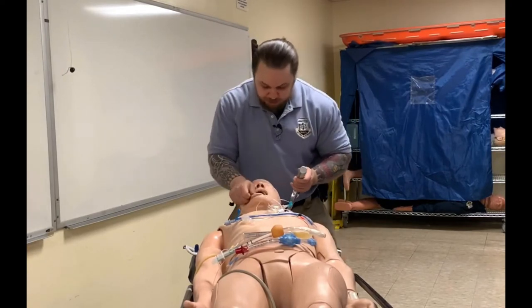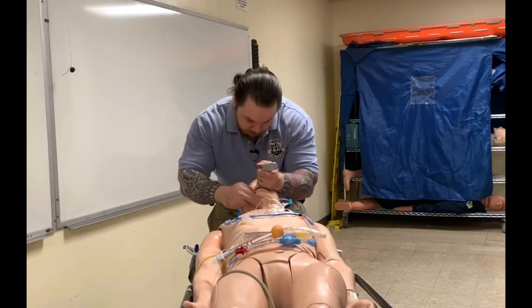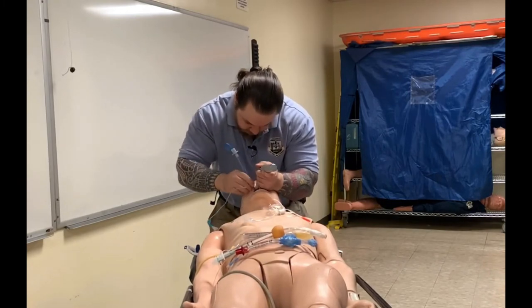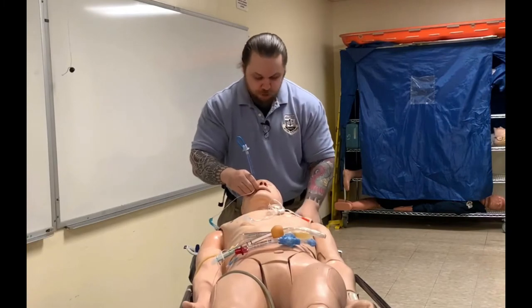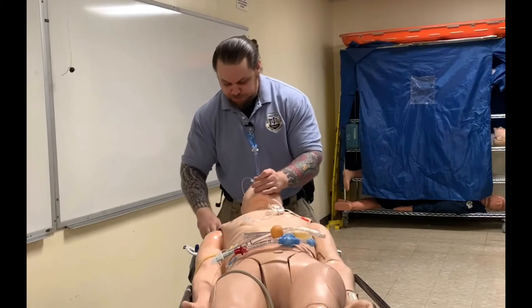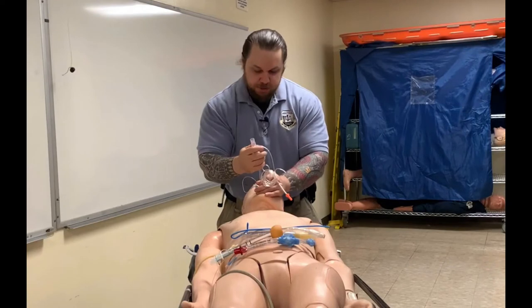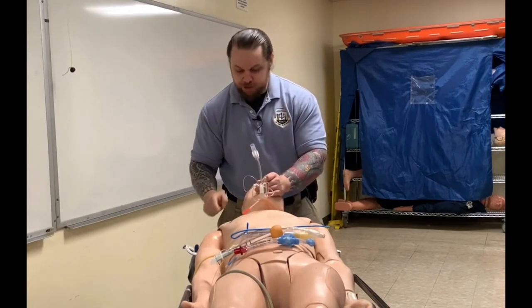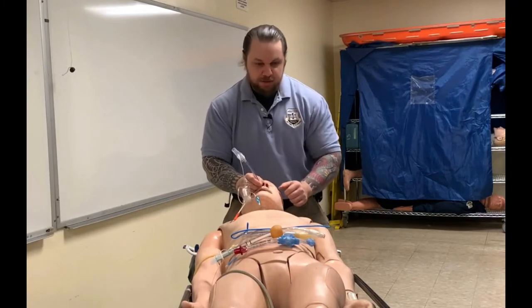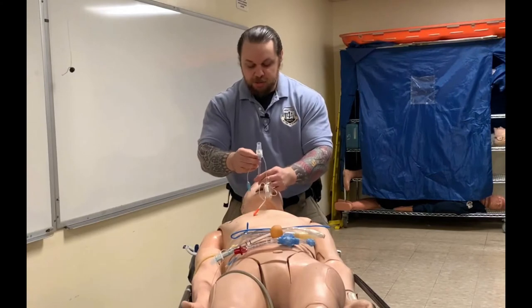I'm going to go ahead and intubate the patient. I saw the tube go through the vocal cords. I'll inflate my pilot balloon, remove my stylet, connect my end-tidal CO2 to verify placement before securing the device — verify with objective data — and then auscultate lung sounds for subjective data.